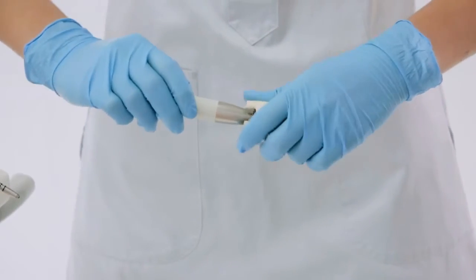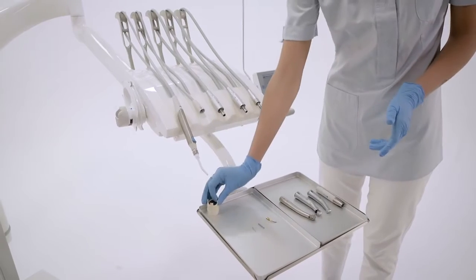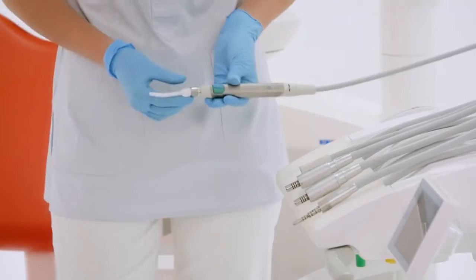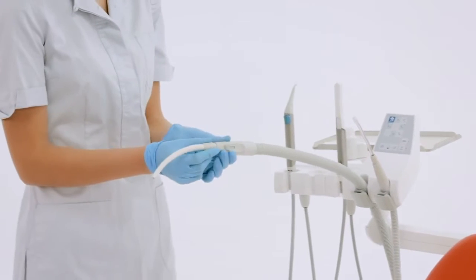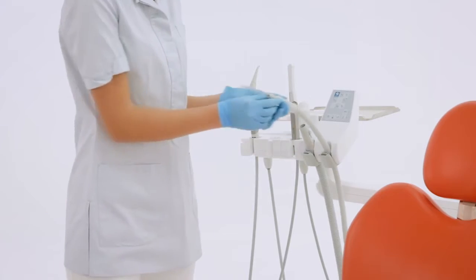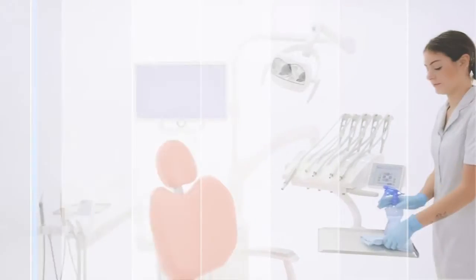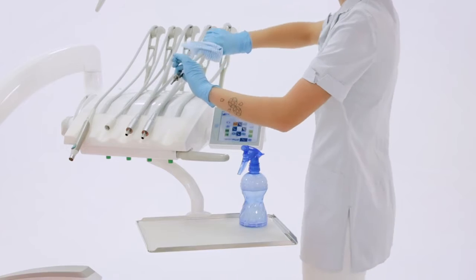The assistant removes the dynamic instruments without their tips and burs, and the cannula ends, and takes them to the sterilization area. The assistant then cleans and disinfects the dental unit surfaces.